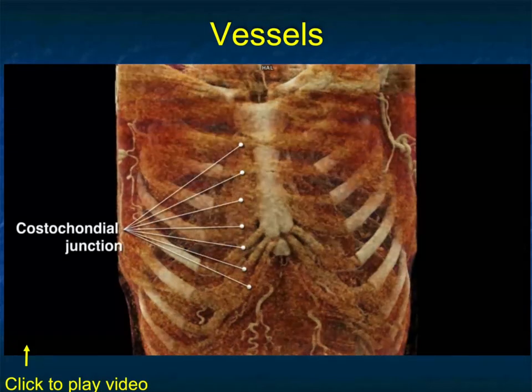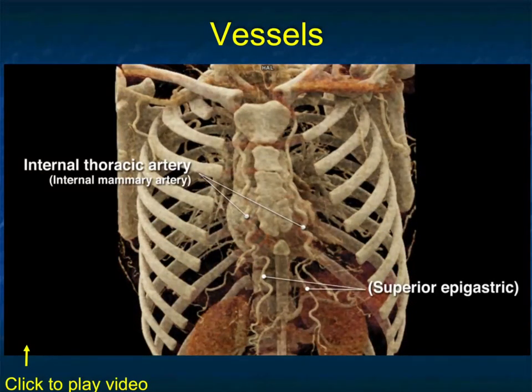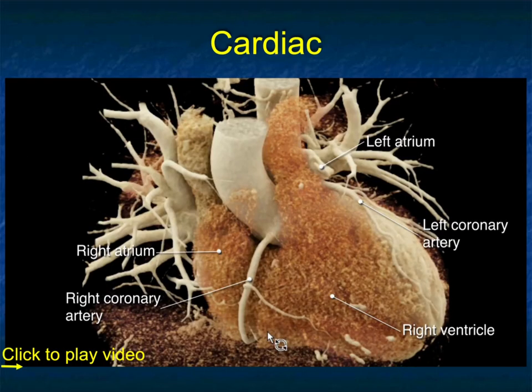It's hard to do better than that. Just looking at a skeleton in your hand or looking at some pictures in a book, no way is it as good as doing like this. Now, no one has really shown that with numbers, but perhaps we should.